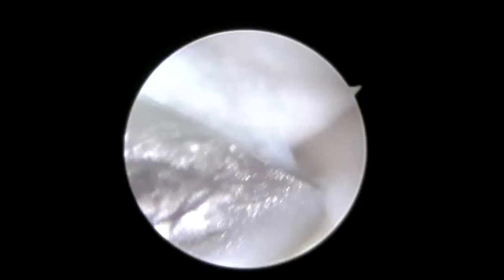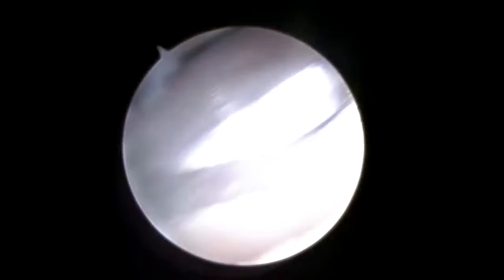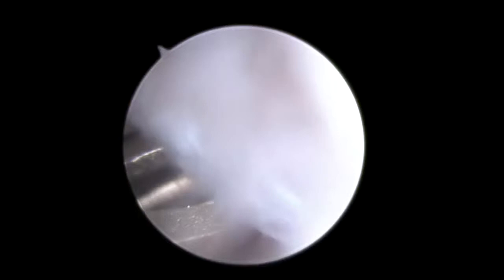You can see that's an intact part of the ligament in the background. I'm just cleaning off a little enfolding portion here. This side looks pretty clean. Now go to the other side where there's a fair amount of enfolded ligament tissue.